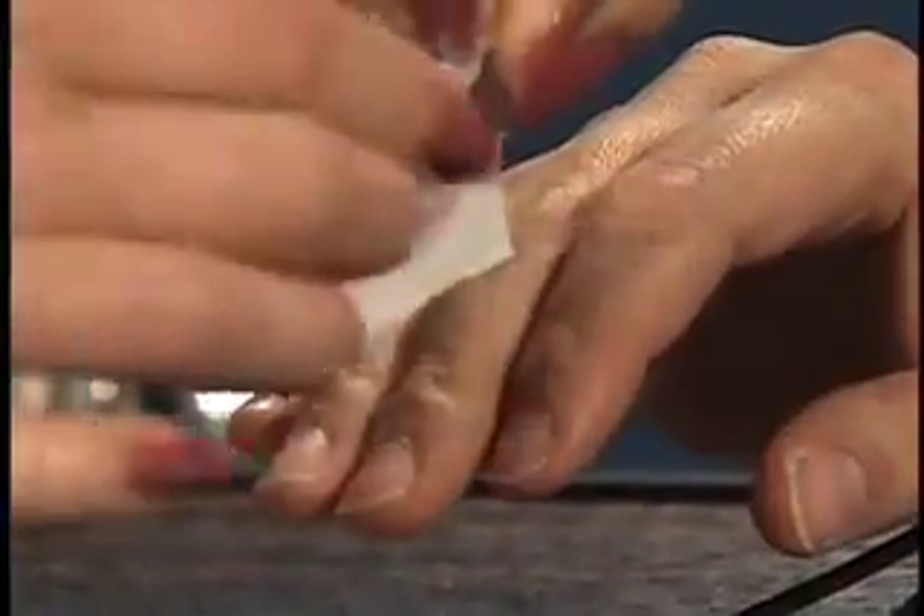Cleanse and dry the selected location and remove nail polish or artificial nails if present.